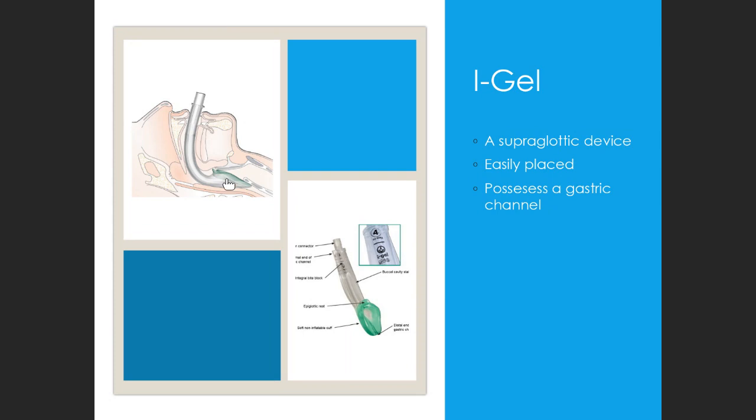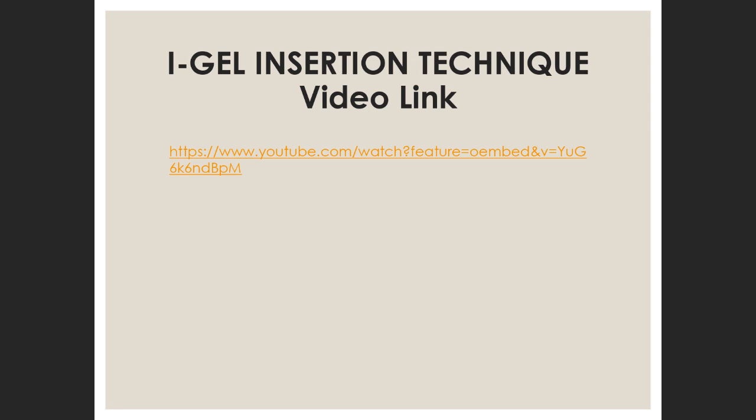So they have worked out the anatomy of the larynx and the supraglottic area, and it fits. Therefore it does not need an inflatable cuff. It has a lip like a mask and sits, but it doesn't have an inflatable cuff. And the tube is kind of wide because they have a built-in bite block.